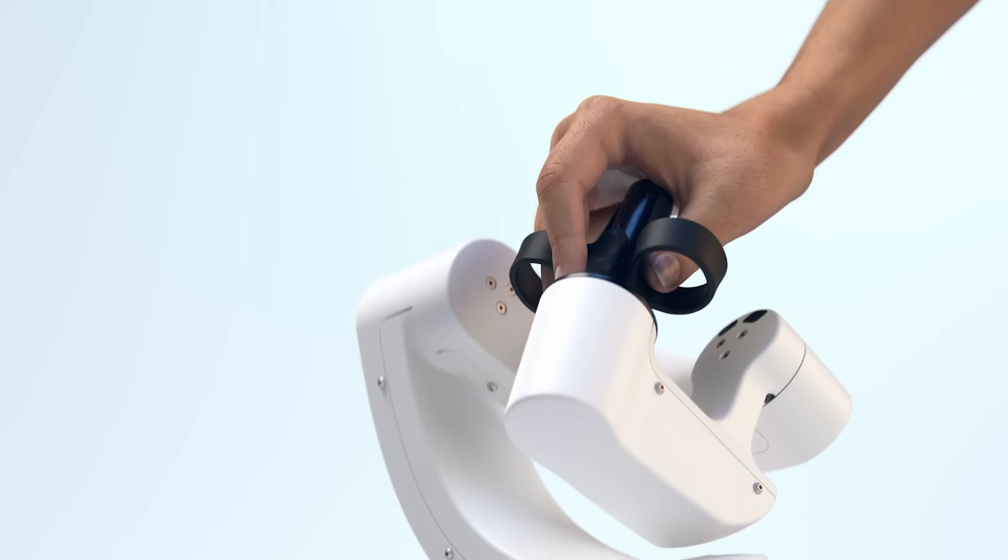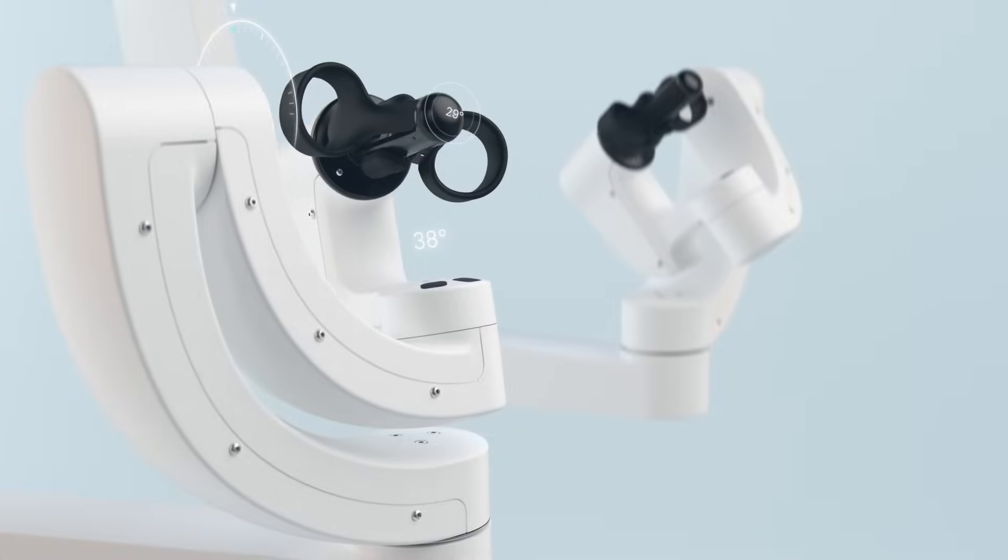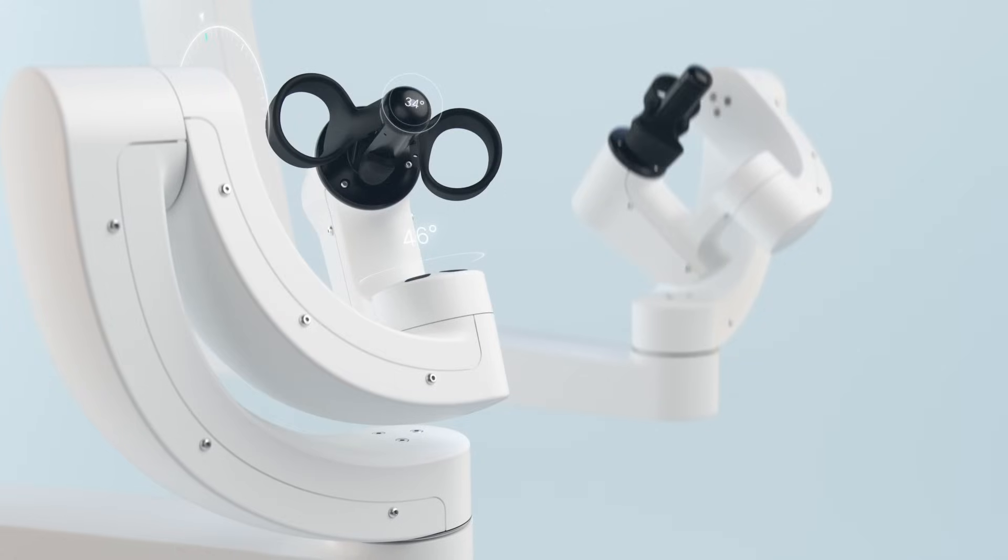Before we relied on visual cues primarily but now with feedback it does give you that extra sense. It's not something I've seen with any other system. It's something we experience in open and laparoscopic surgery but not robotic surgery.